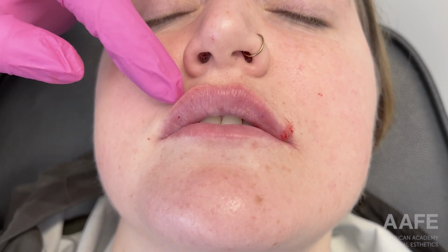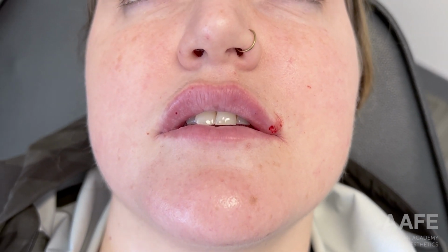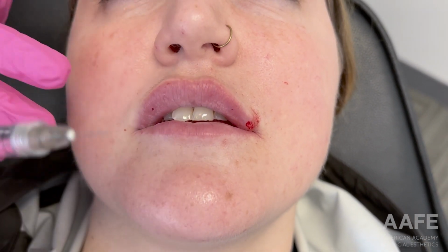Now, if you'll notice, this patient has a little bit of this soft tissue swelling above the lip. That's not concerning. Of course, that's going to go down. It starts to look a little shelf-like. This patient actually likes the way that her lips look when they're a little swollen, and we talked about that when she came in. Sometimes when you wake up in the morning, or maybe you drank the night before, or you get a little bit of sun, sometimes your lips will end up a little bit swollen, and some people like that look. So that's the goal. We're going to kind of try to get her there with some filler.